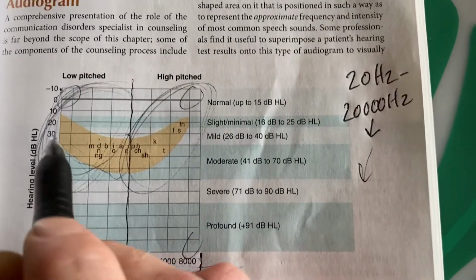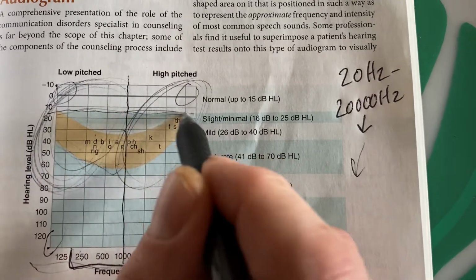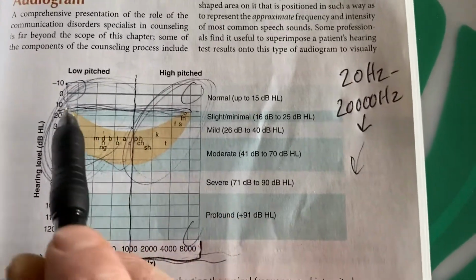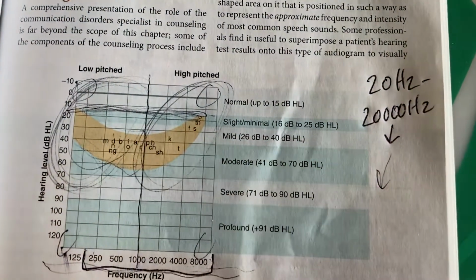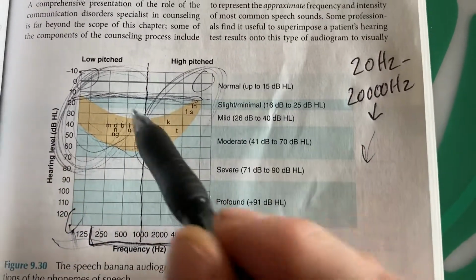Most people have hearing right around here. If we were to measure somebody's hearing, their ability to hear, if your hearing was normal, all of your results would be here, meaning that you can hear everything below that line that I just drew. This is the essence of audiology.